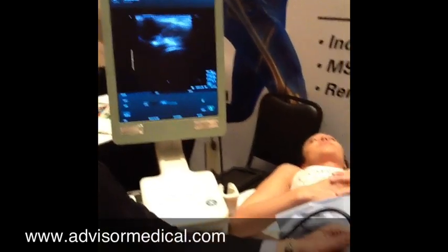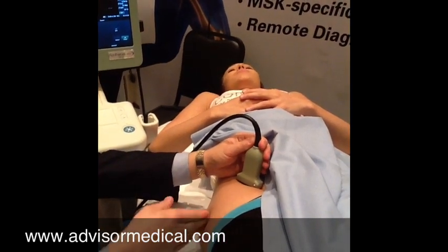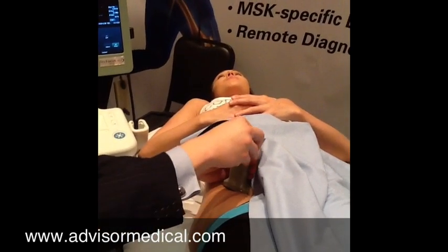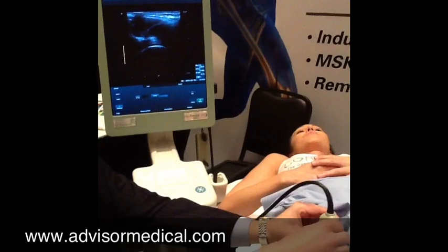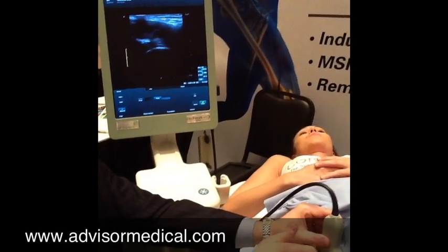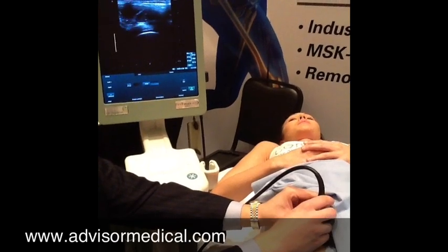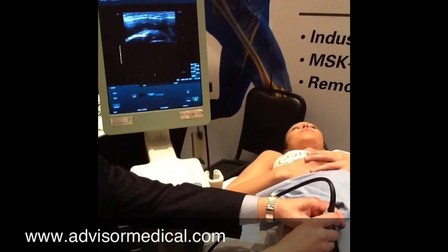Take a look at the position of the probe — I know the trochanter is over here and I want to see the length of the femur. So all I'm going to do is find my femoral head and then rotate to the length of the femur, the long axis. I have the femoral head in my screen here and I'm just going to rotate on that and as I rotate, you're going to see it elongate.